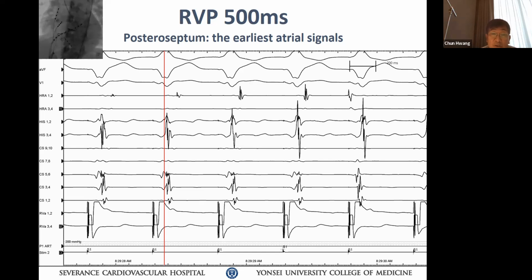That's why the signal you're looking at is only RV. Now, if you compare that signal to what you just saw, the second complex, the small notching, is gone. Right? So that's why I always look for the difference, and then you will always find the answer there.